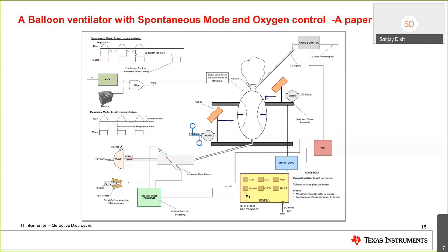Within this basic ventilator, you really have some kind of a system which may have an MCU driving a motor, which is pushing this out at a certain rate. And you can control the timing of the motor so that this bag is pushed, the motor moves in slowly or moves in hard, so that you can control the strength, as I was talking about, of the air which is blown in. But this is not very accurate.